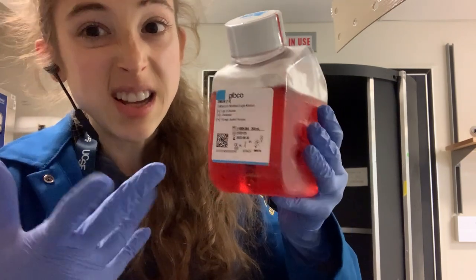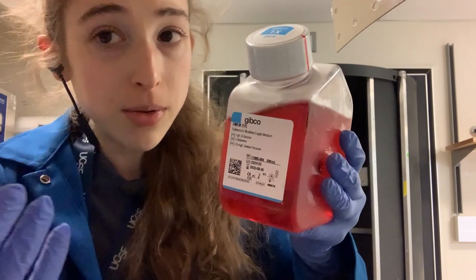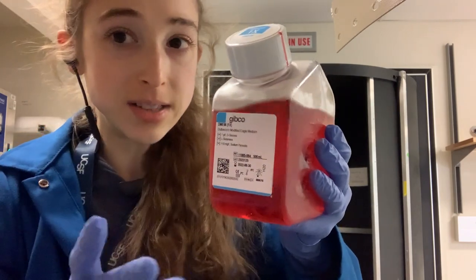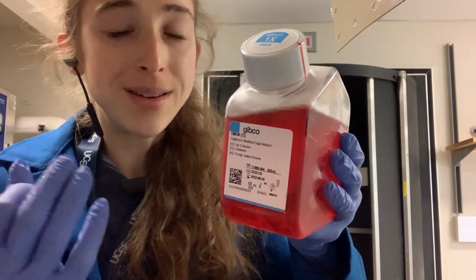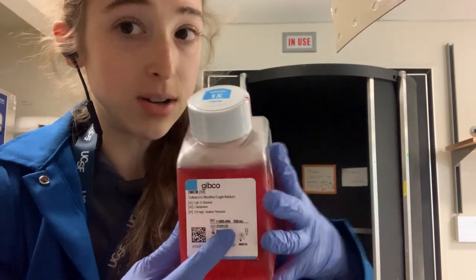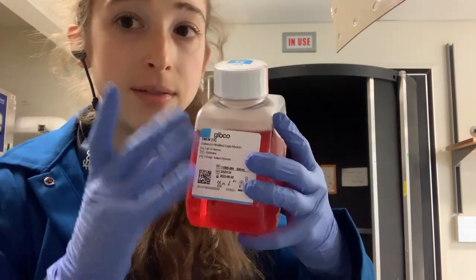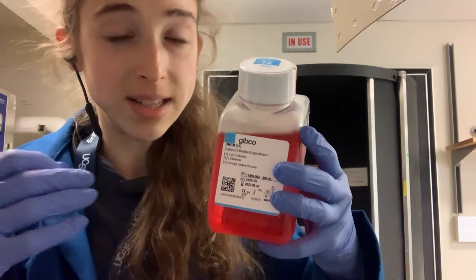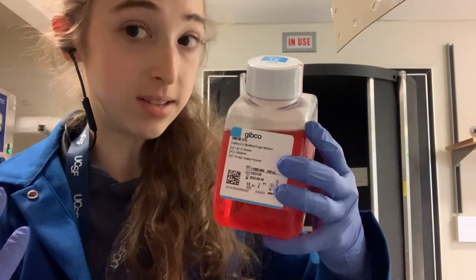But when it comes to these more specialized cells, they're more picky. The media we use — the food we use to grow them in — is going to be more specialized for the different cell types and more expensive. But there are some basic things that these all have. They typically have a base or basal media, and then you supplement it with various things depending on the cell type.